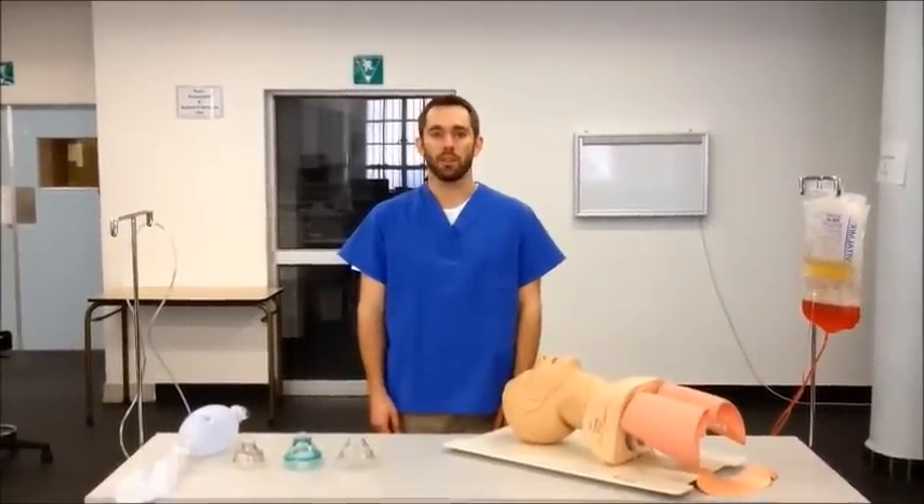Hi, this is Almir Ustazen with Cape Town Emergency Medicine, here today to talk about assistive ventilation using a self-inflating bag valve mask device.